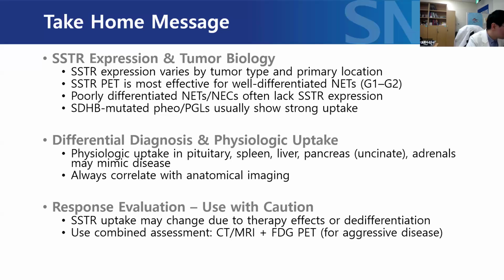And for the clinical usage of such an SSTR PET, we can use it for the differential diagnosis of the lesions. However, physiologic uptake should always be considered in such cases, and more care should be taken with a lesion located in the uncinate process of the pancreas head, which has a high physiologic uptake.